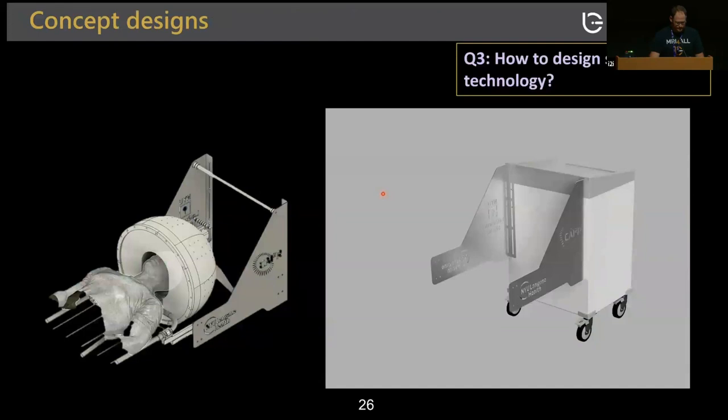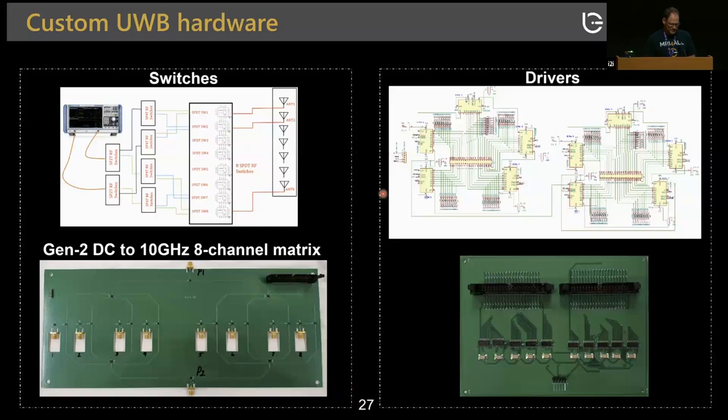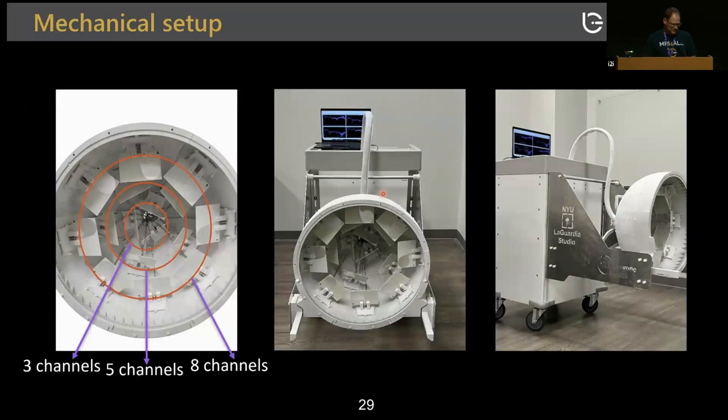Based on this information, we had enough to start building a scanner. We designed and fabricated ultrawide-band switch matrices and drivers in the lab, 3D printed all parts, mounted everything on a cart. The antenna array has 16 antennas in rows of eight, five, and three. This is how it's mounted and sealed. This is the first volunteer we had, with Mary Bruno assisting with the scanning.